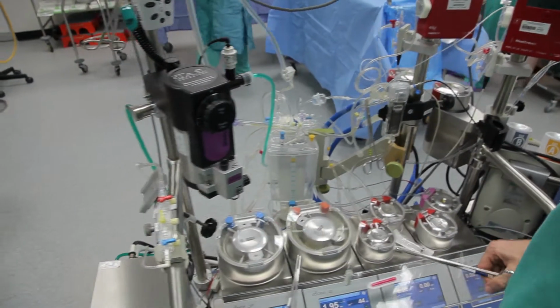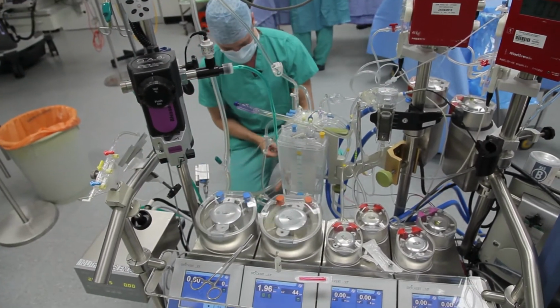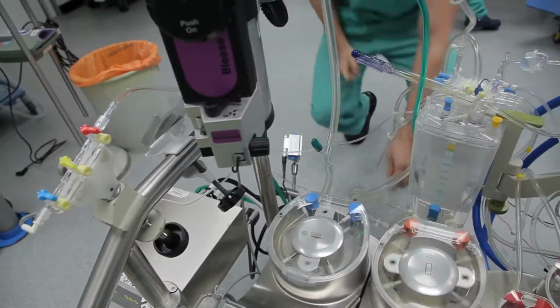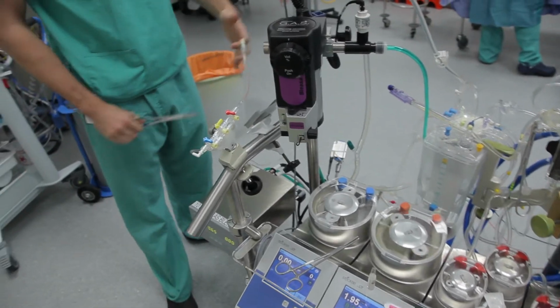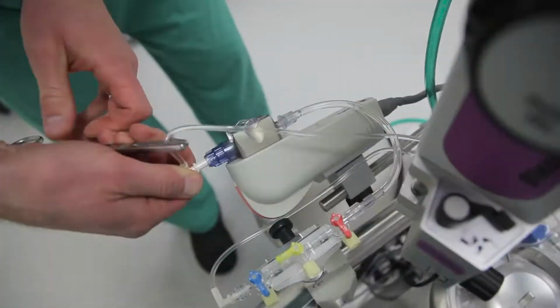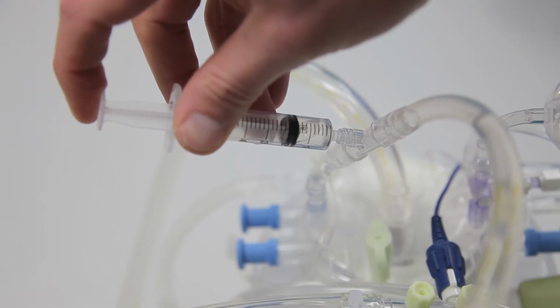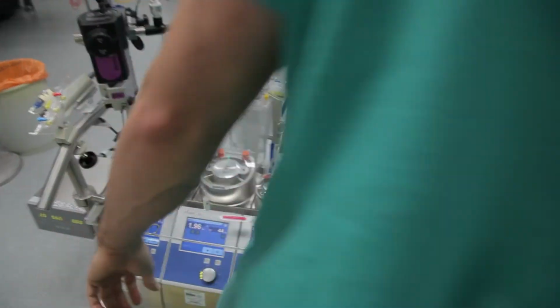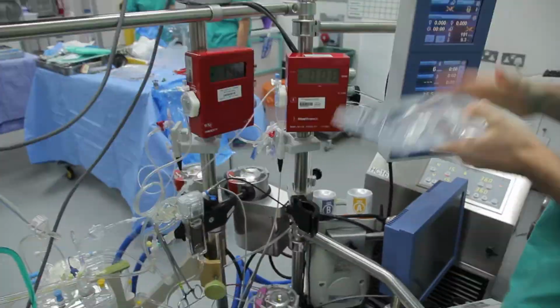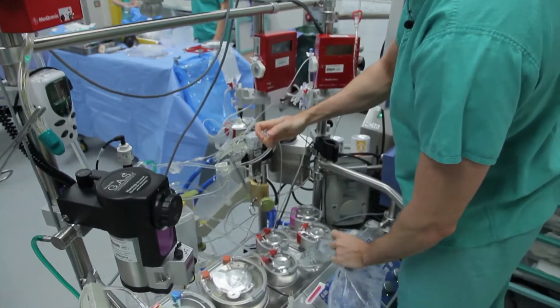We just need to add on the CDI. So just tap the CDI, 1-way valve, make sure there's no air in that. Turn it off. Clamp this side of the connection. Put in 5,000 units of heparin. All we need to do now is put on the cardioplegia bag and put the plasma bag back onto the oxygenator.